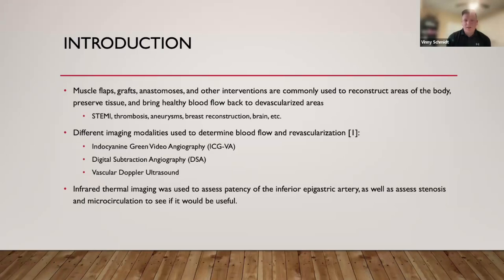These are all the standard of care in medicine when it comes to things like this. What I wanted to go through was seeing how infrared thermal imaging was used to assess patency of the inferior epigastric artery, as well as assess stenosis and microcirculation, to see if it would be of use, especially in an intraoperative setting.